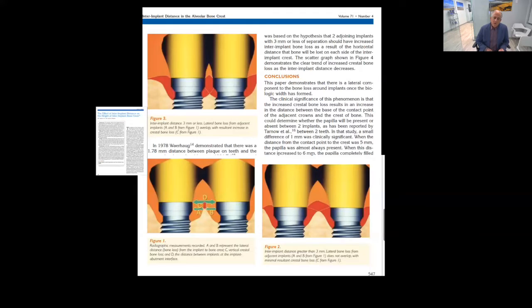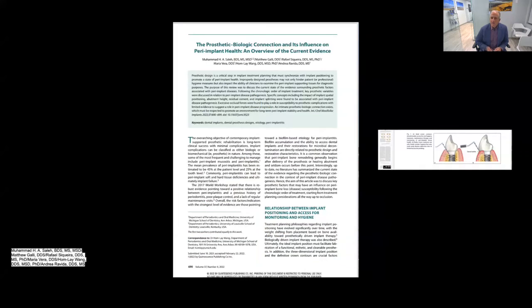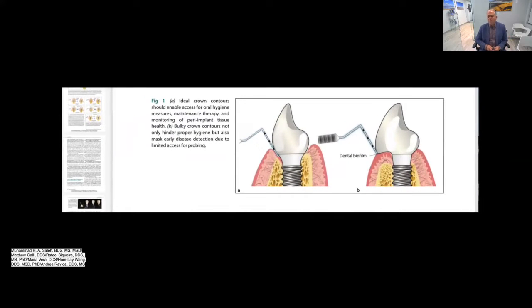So if we look at what I feel is critical, it's the placement, subcrestal, cingulum area, how far apart they are to each other, and then really the prosthetic design. And what we don't want is we don't want a really big ridge lap. We want to make sure that the areas are cleansable, and all of this will lead to really successful implant placement.